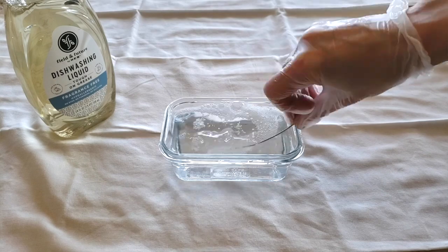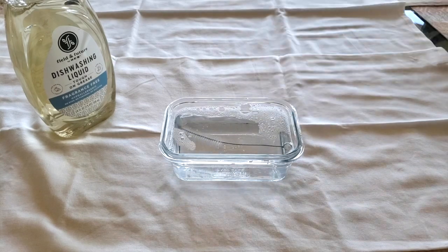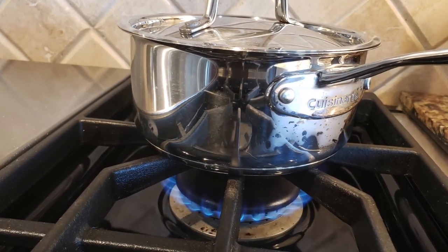Swirl the brush in the water and allow the brush to sit for 30 to 60 minutes. Heat up a small pot of water to a boil.